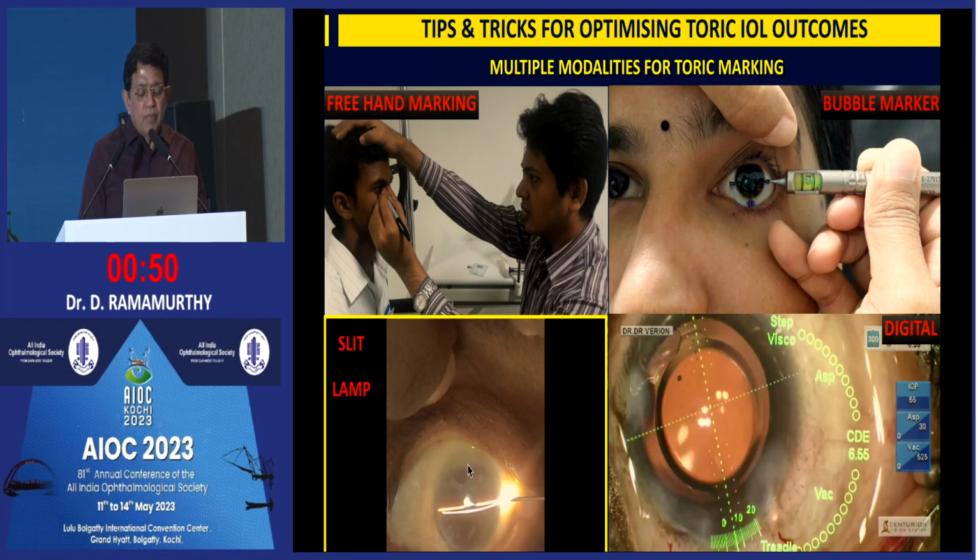Otherwise, if you do not have access to a digital marking device, then use a slit lamp before the pupil is dilated, creating a slit cutting across the pupil. I usually use a 26 gauge needle to mark, creating a small subconjunctival hemorrhage over there, which will not disappear during the surgery.